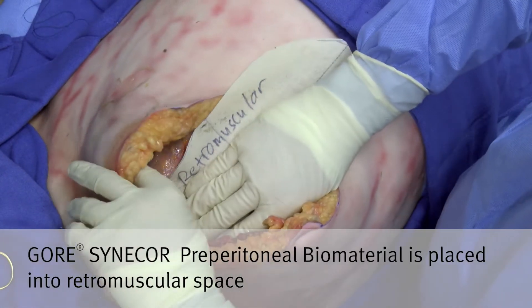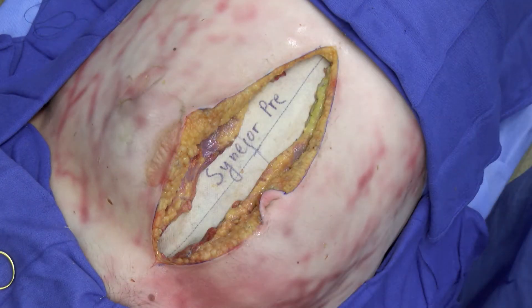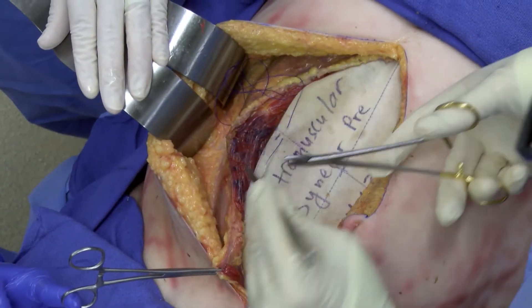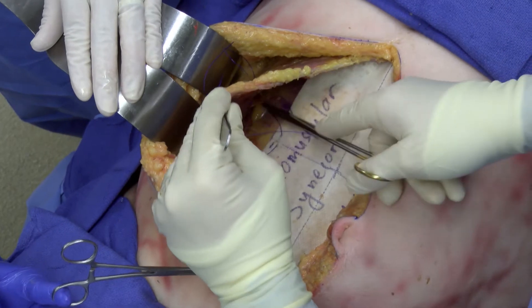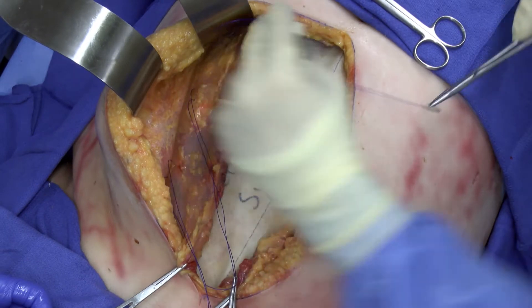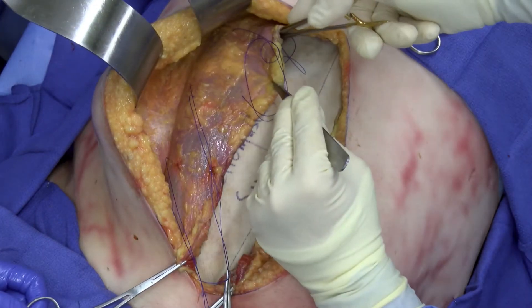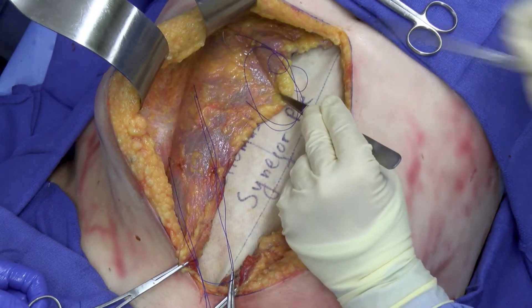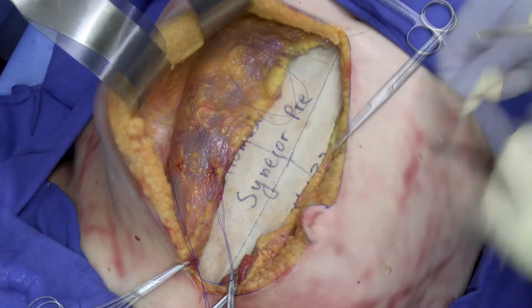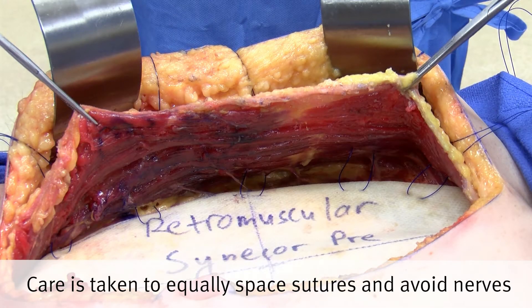The mesh is carefully placed into the retromuscular space to assess fit, and transfascial sutures are placed to reinforce the abdominal wall and to pre-tension the mesh, unloading the anterior fascia. These sutures are placed avoiding the epigastric arteries as well as the intercostal nerves and are spaced appropriately. Care is taken to equally space the sutures and avoid the intercostal nerves.